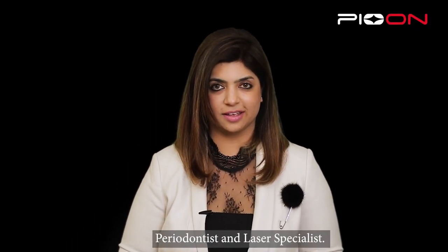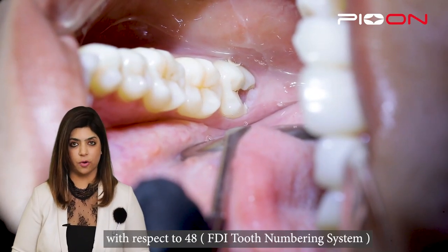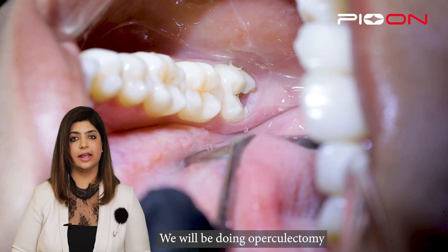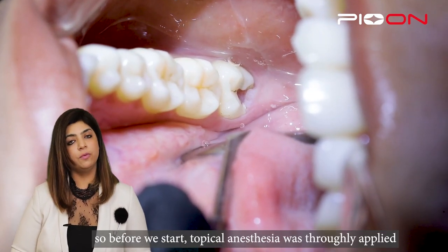Hello everyone, I'm Dr. Sana Farishta, periodontist and laser specialist. Today we're going to showcase a case of operculectomy in respect to tooth 4-8. We are going to do an operculectomy followed by restoration of the same.